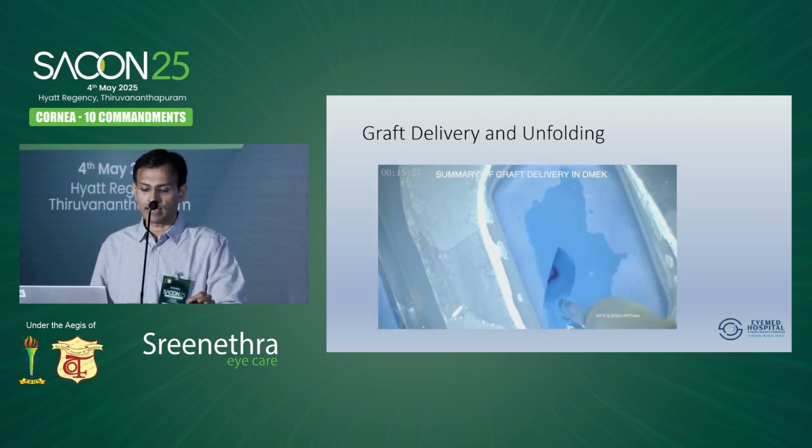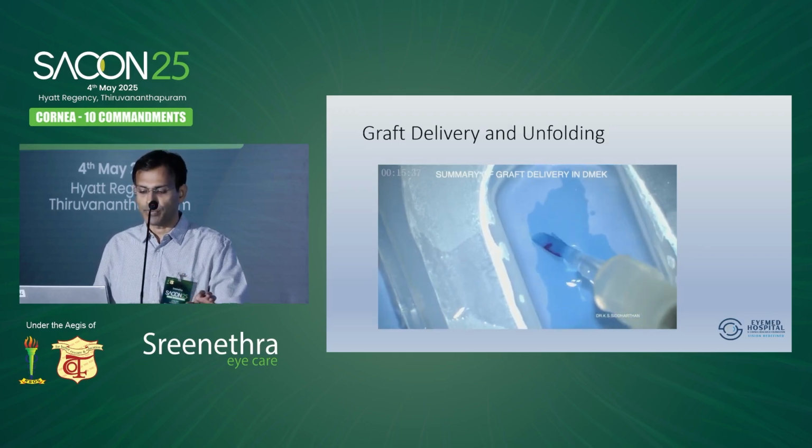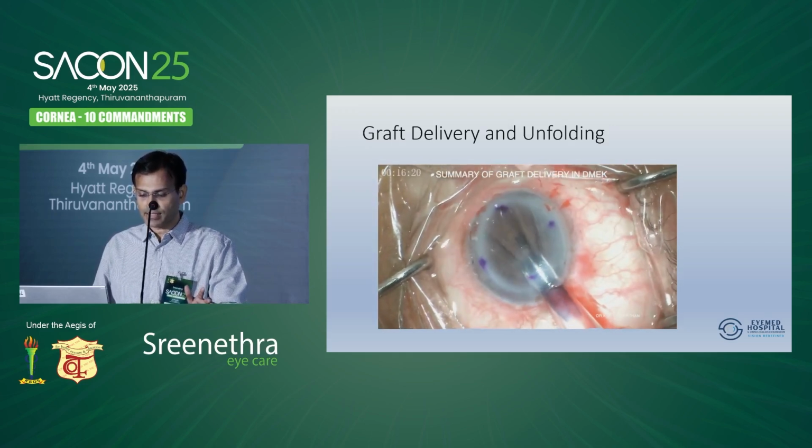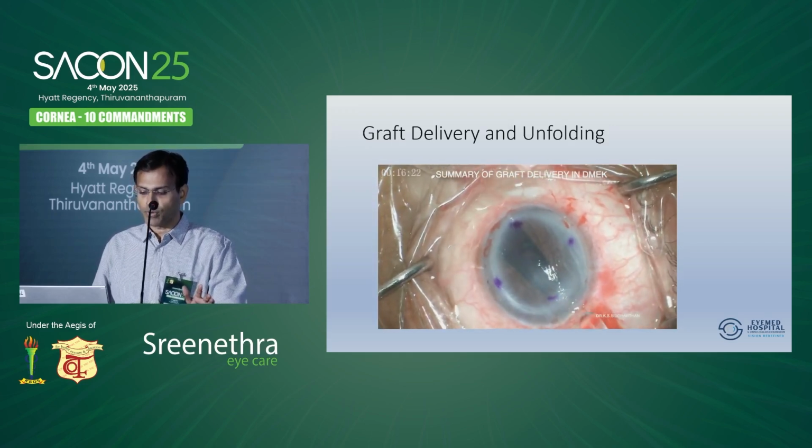See, all these things, the tear can happen anytime. It is not that it can happen only when you strip, when you punch, or when you take it in the syringe. Anytime it can happen. And go inside and inject it. Be very gentle about it.